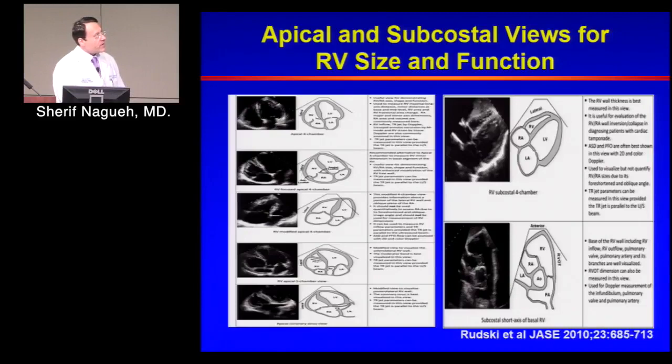We can measure the basal dimension of the right ventricle. So this is basically a measurement below the tricuspid annulus plane. It is performed someplace in the basal third before the papillary muscle. And you can also do another distal measurement, distal to the first one, more in the distal third after that papillary muscle, if you would.